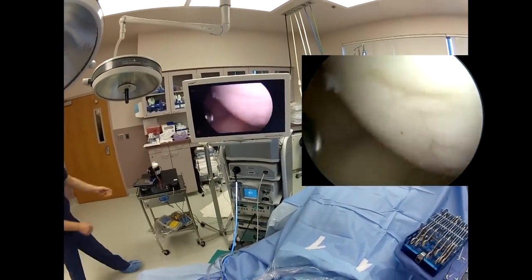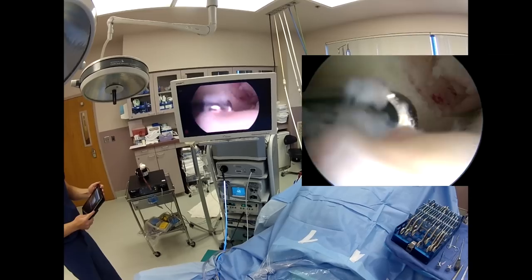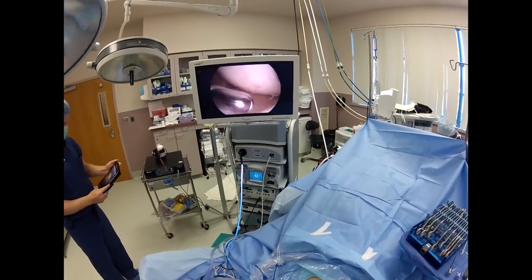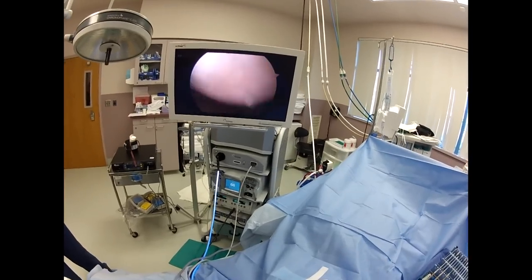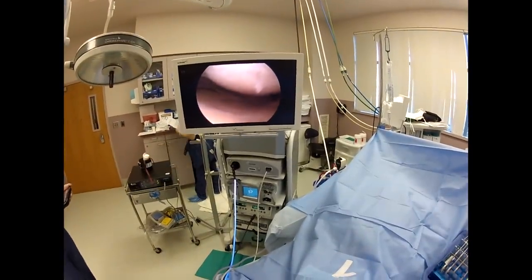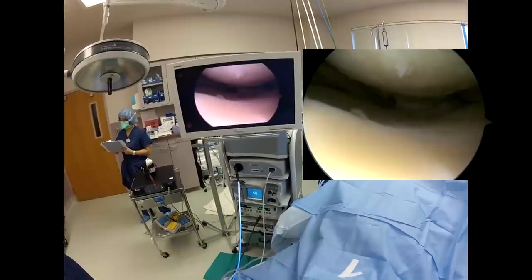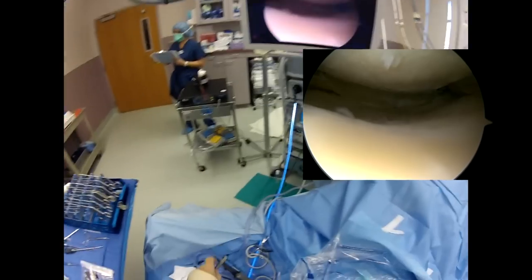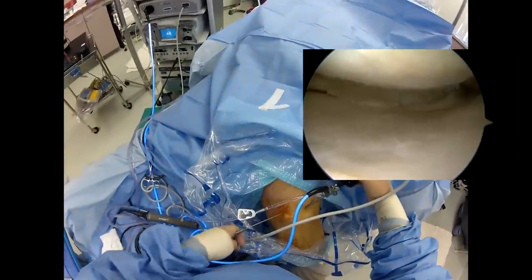We're going to do a little synovectomy — get rid of some of this synovitis in the knee that's causing her some trouble. As you can see right here, there's the tear of the meniscus. Using the upbiter to get a little better view there — you can see it's all kind of torn and macerated.